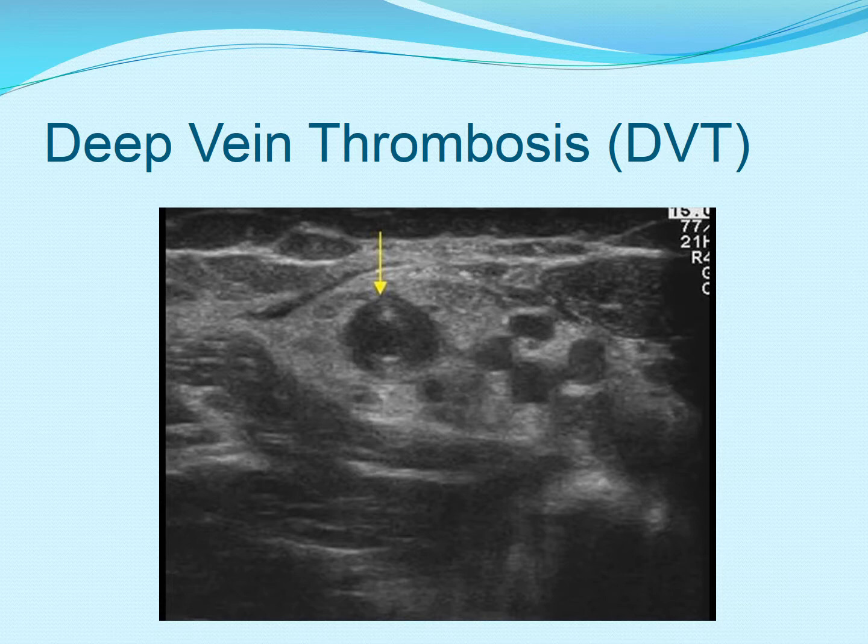You want to advocate for your patient to get a duplex or an ultrasound to evaluate DVT. If it's clear and safe to go, then you can appropriately cannulate that vessel. If not, you've then helped diagnose the patient who has a DVT.